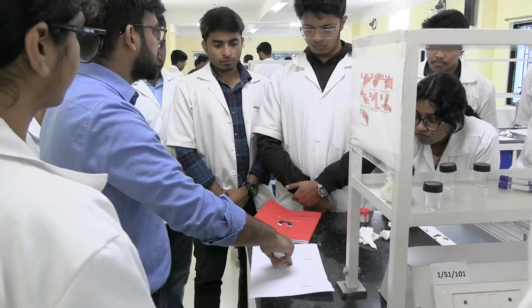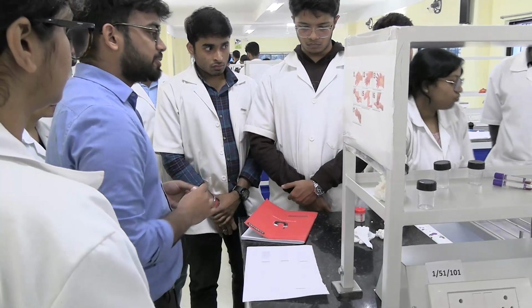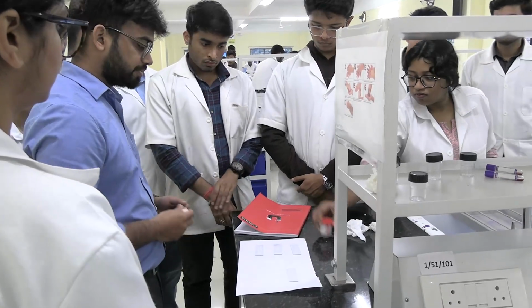First of all, you need to give a prick. Who is going to volunteer for the prick? Do you have that spirit? First, clean your finger.